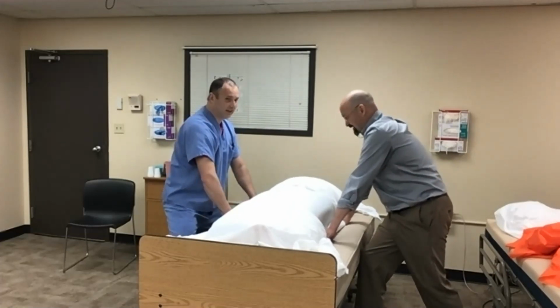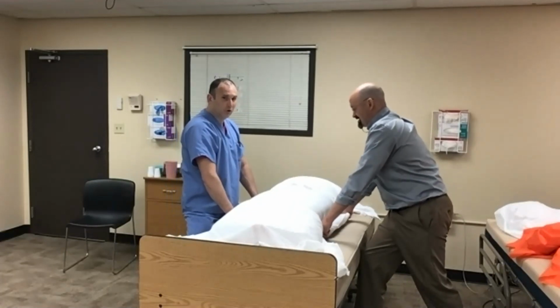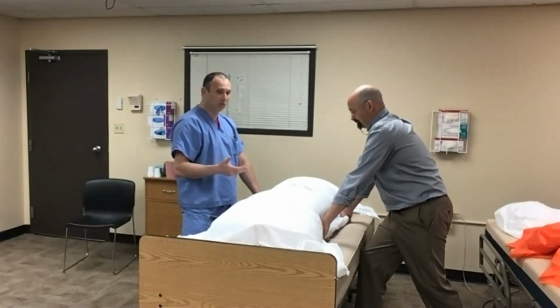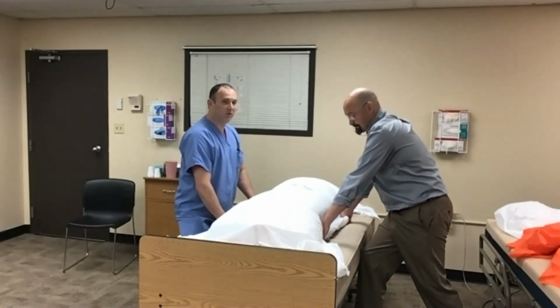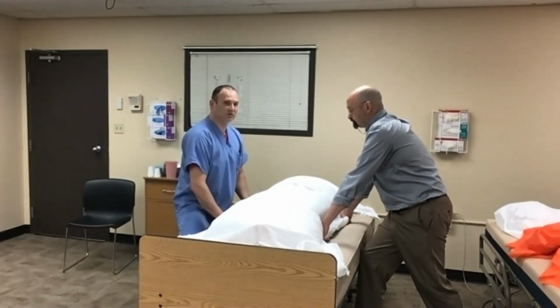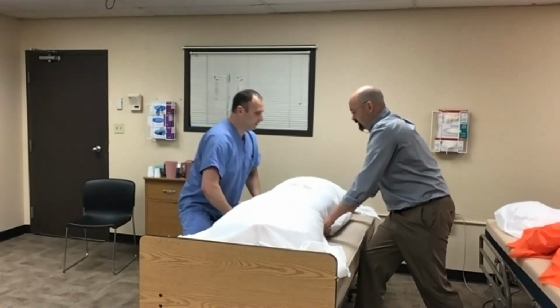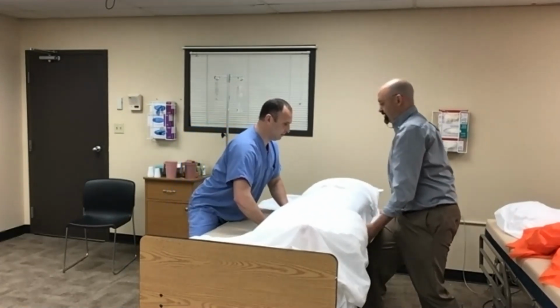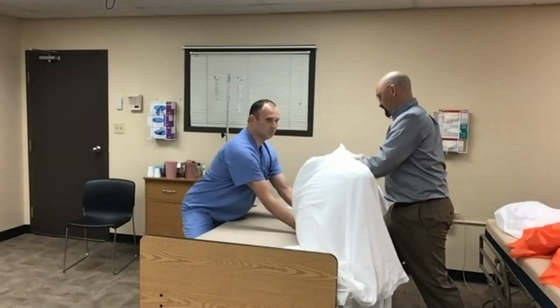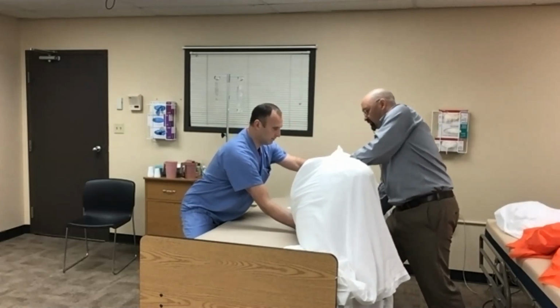Exactly. Okay, so less mechanical advantage. Same technique, more effort from you. In this case, make sure the bed is raised up appropriately so that everybody's about waist height, and you've got to get your butt down. Move through your base of support. Okay, coming my way. On 3, 1, 2, 3, over. 1, 2, 3, up. And when you get to here, you're going to grab 1 up top. You're going to have to grab 1 at the bottom because you're going to have to pull and turn at the same time.